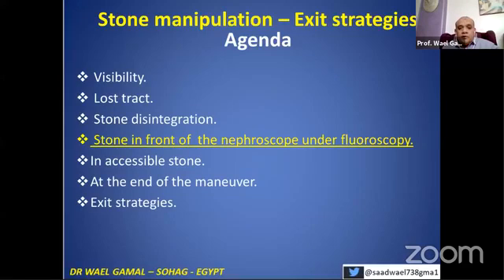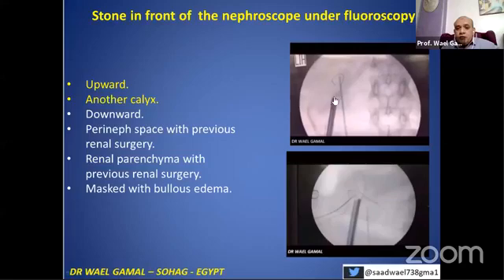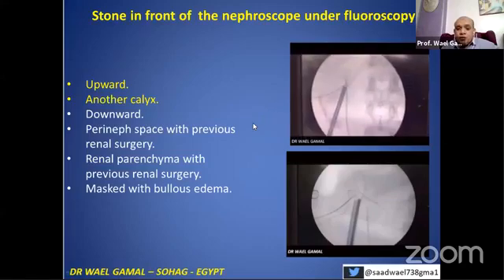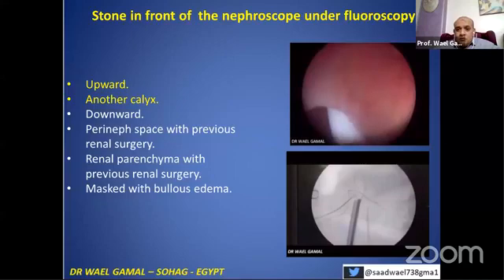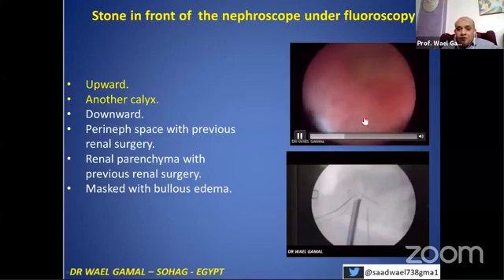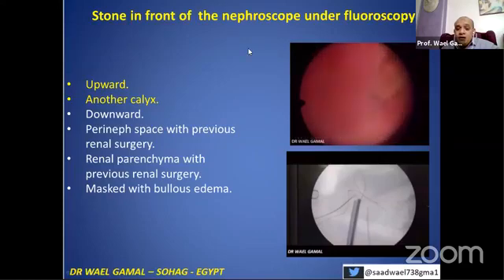Sometimes intraoperatively, you find the stone in front of the nephroscope, but actually you don't see the stone clearly. In this situation, you have to look with the tip of your nephroscope. Here, looking — here is the tip of the stone. This location is deep, with no way to enter with the flexible. To manage a case like this, we use a needle from the outside and try to manipulate the stone. You can see the tip of the needle here.